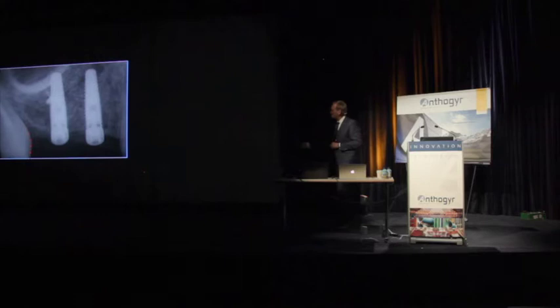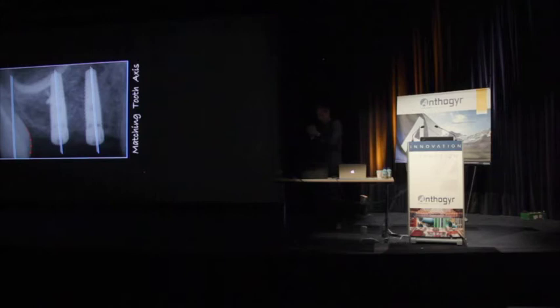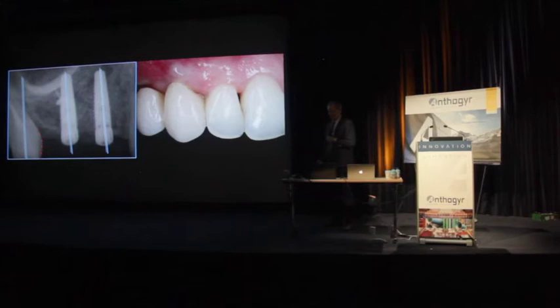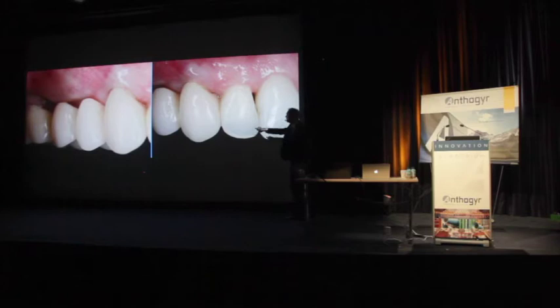So this is after the surgery. I did horizontal augmentation, bone augmentation, and sinus elevation, placed the two implants, and I treated the perio part up front as well. So this area has been treated. I grafted bone to rebuild the interdental bony peak between the canine and the lateral incisor. So here we are, you can see the volume of the bone augmentation, and here we are 8 months down the road.